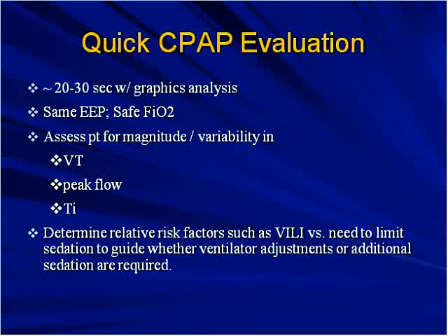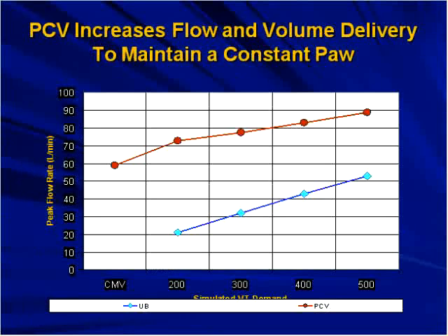This should guide the physicians and the respiratory therapists to huddle together to figure out a care plan. So in patients with ARDS, or patients who are very much at risk for ventilator-induced lung injury, particularly early in the course of their lung disease, probably lung protection is much more important, and sedation should probably be increased. On the other hand, patients who are recovering from their disease, who are trying to wean and drop their sedation level and get them extubated, they're probably at less risk of ventilator-induced lung injury. And liberalizing our ventilator settings or putting them in a spontaneous mode entirely may be the appropriate choice.